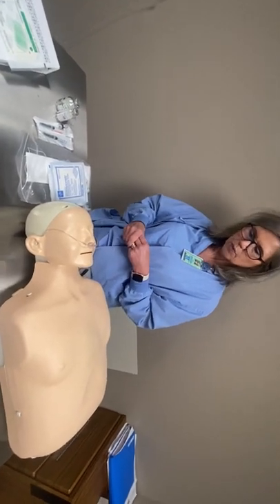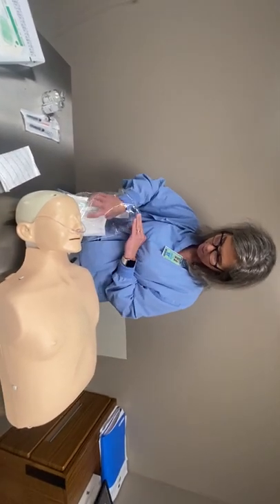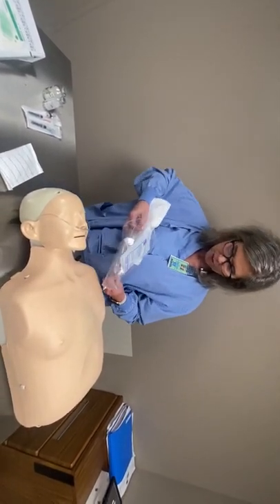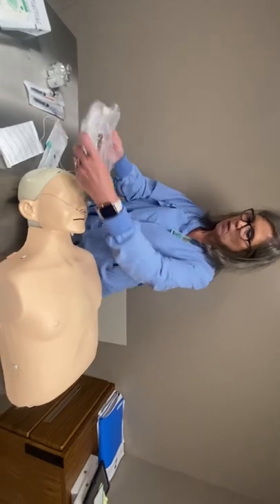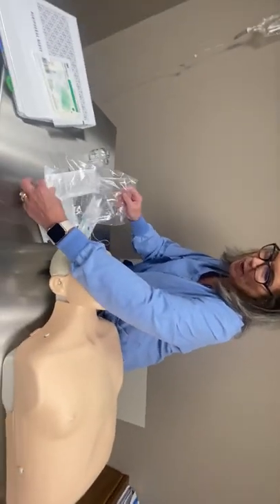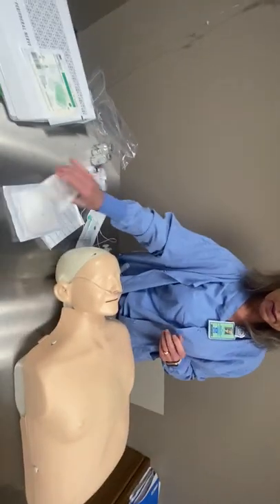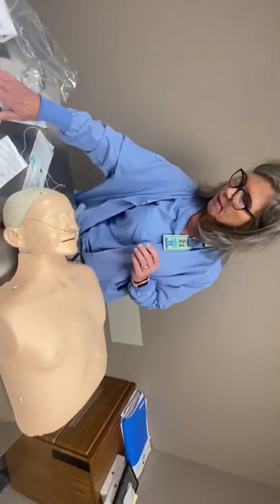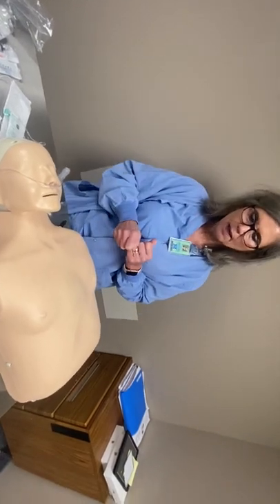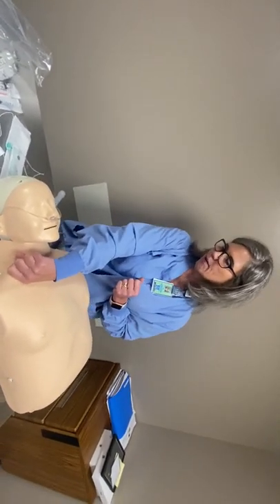Once you've done the timeout, hand your bag of supplies to the anesthesiologist. They'll take everything out — you'll want to keep the Versed syringe because you'll be using that. Everything else the anesthesiologist will be using, so get that over to them. You can lay it on the patient's bed or pull in the bedside table. The anesthesiologist will first clean off the ultrasound probe, and once that's done, hand them the probe so they can scan the patient.